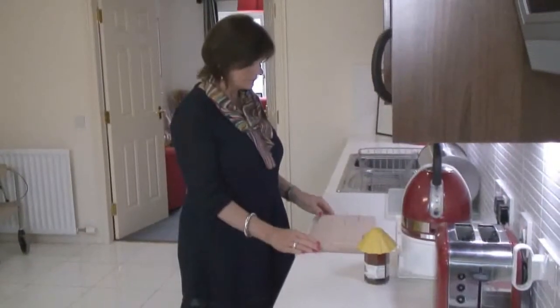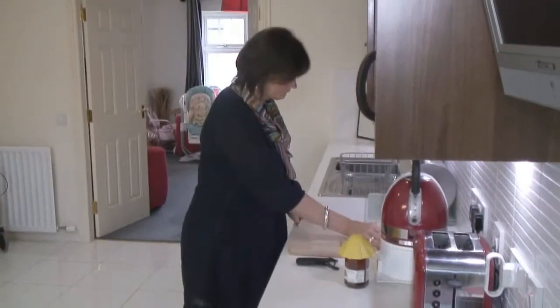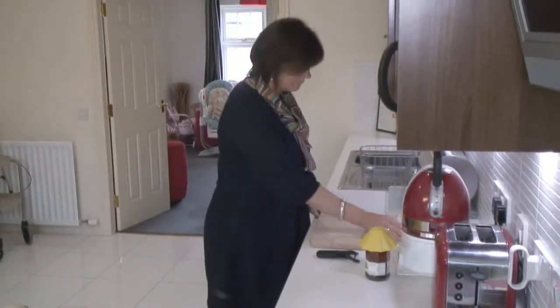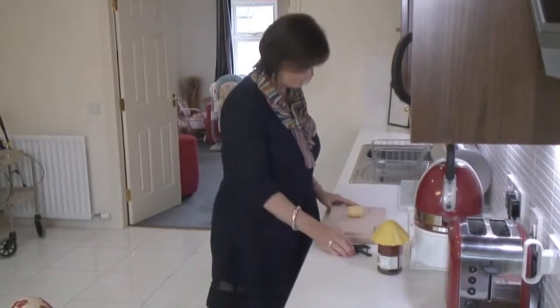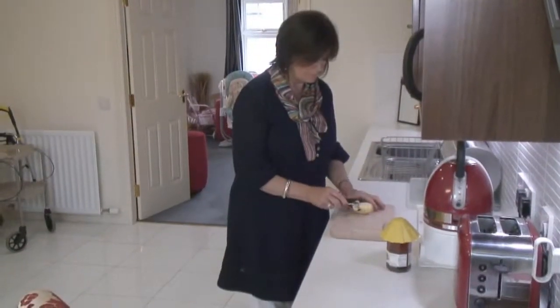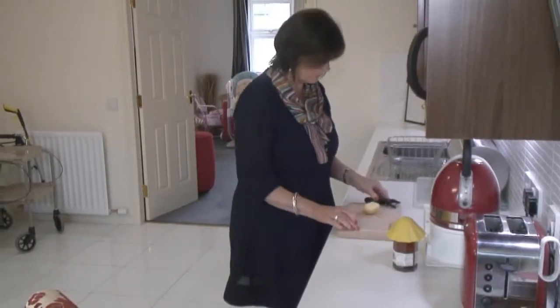So here we have a number of items which are useful in the kitchen. This particular item is great for people who have limited hand function, or particularly where somebody just has the use of one hand. The spikes in the board will allow you to secure fruit and vegetables, and will allow that to be held in place while you use a peeler, so you're able to do that one-handed. Also in the corner of the board you will notice that there's a wooden edge, and what that allows you to do is place, say, a slice of bread there, and it will hold it securely in place while you butter it. It can also help with securing vegetables there while you chop them. So that allows you to do a number of activities one-handed.